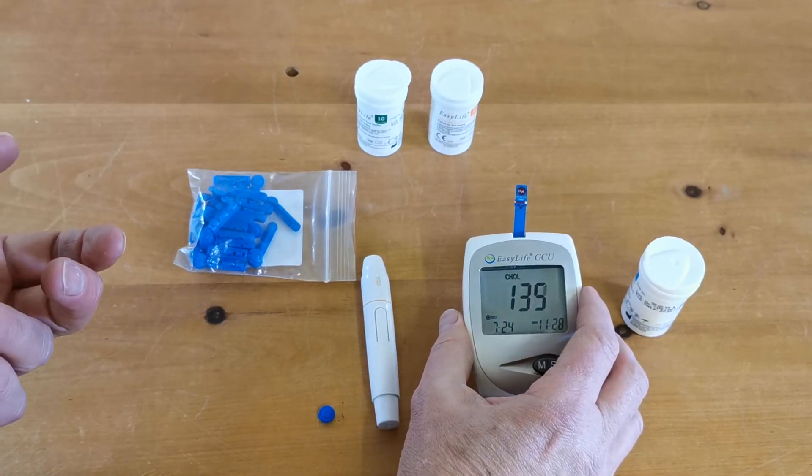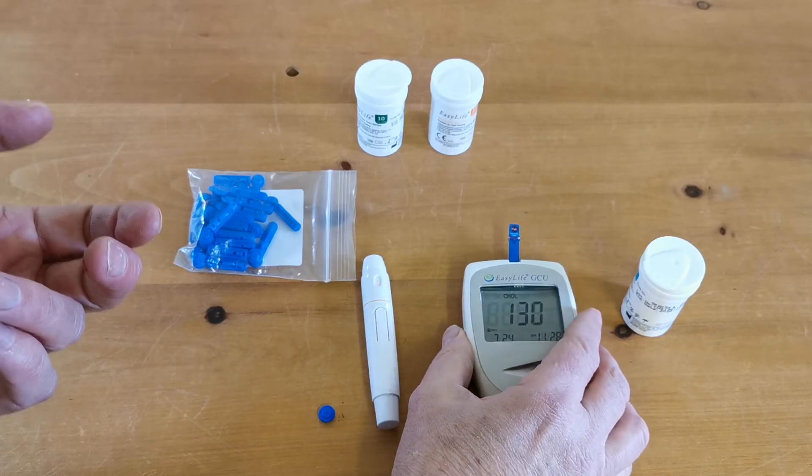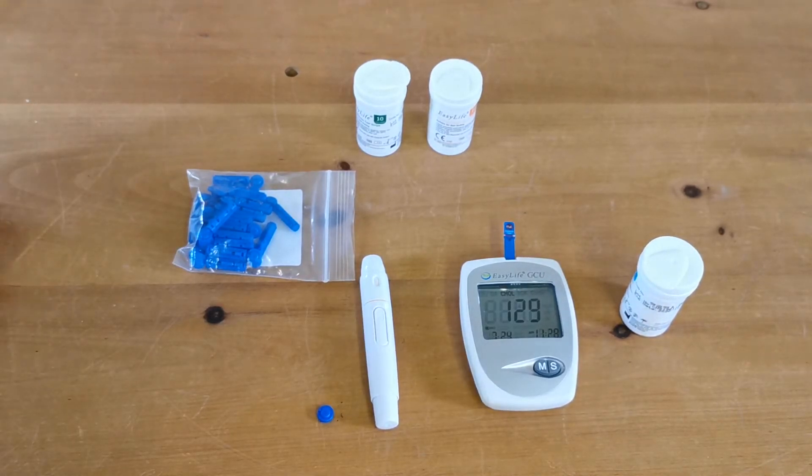This takes quite a while for cholesterol because it's a complex calculation. It's much quicker for readings such as blood glucose.